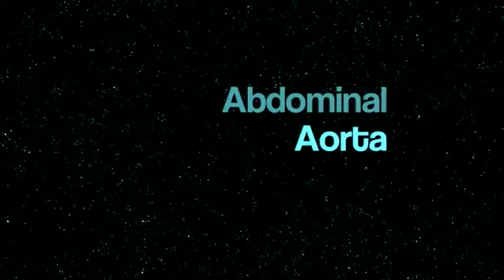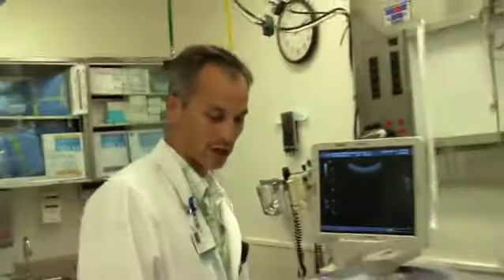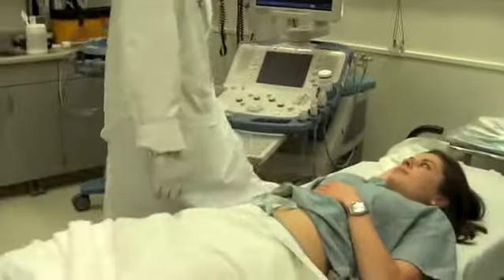The next application we're going to do is the aorta. One other tidbit that I'm going to add is, as you approach the patient, make sure you maximize your comfort so as not to hurt yourself, and also to help maximize your images. As you come up to the bed, raise the bed to the height that works best for you. I'm going to raise the bed up a little higher for myself so I don't have to hunch over. I can maximize the image.